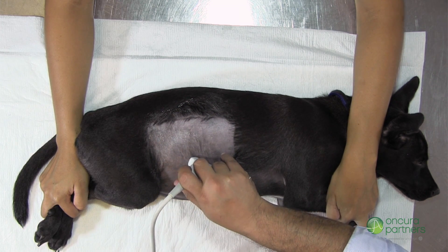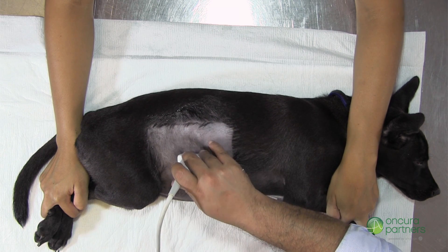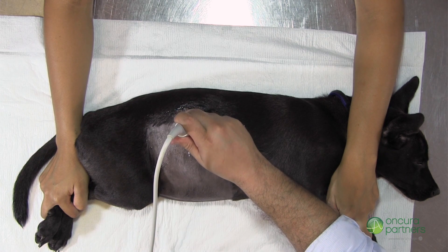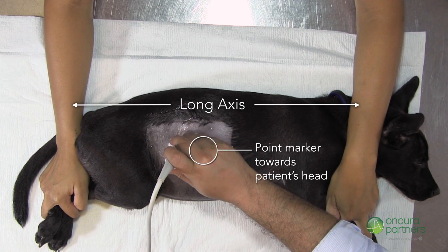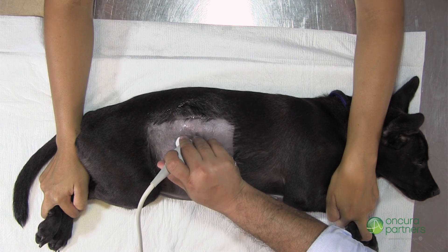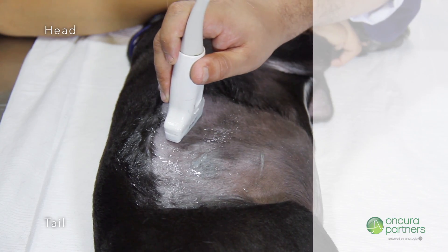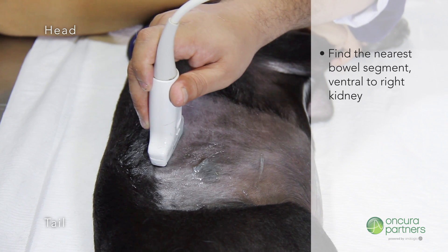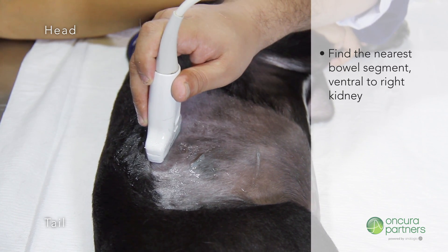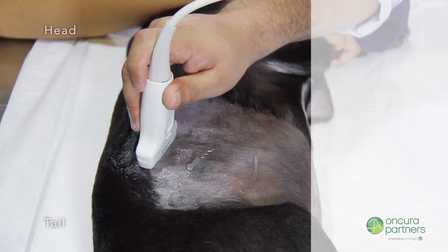The duodenum lies superficially along the right lateral wall of the abdomen. To begin, locate the right kidney by placing the transducer in the long axis, pointing the marker towards the patient's head. Then open the scan field of view or slide the transducer ventrally to find the nearest bowel segment ventral to the right kidney. The duodenum is the thickest segment of the small bowel; it should appear thicker than the neighboring bowel.